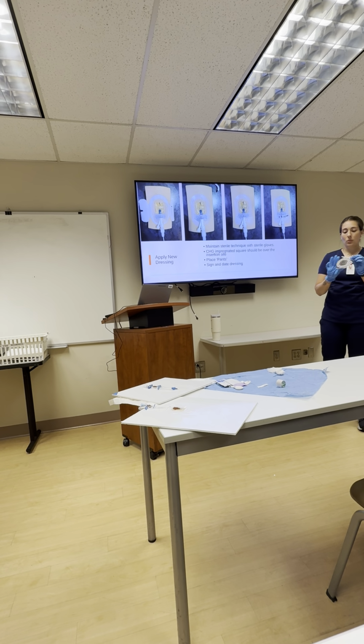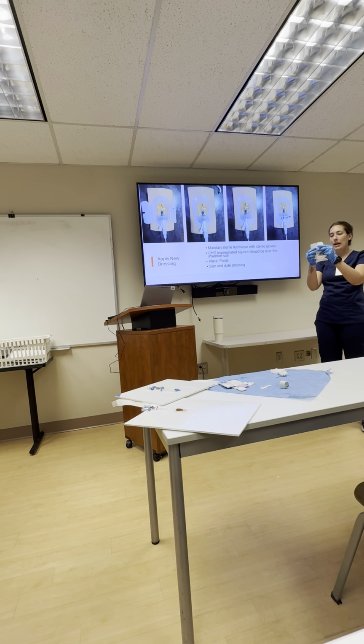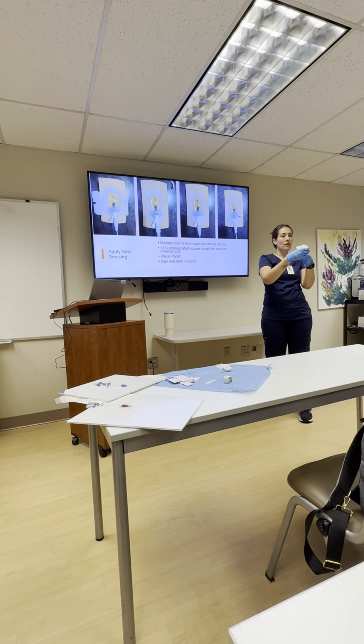Once we did that, we're going to be left over with what I like to call the pants. It's this piece.